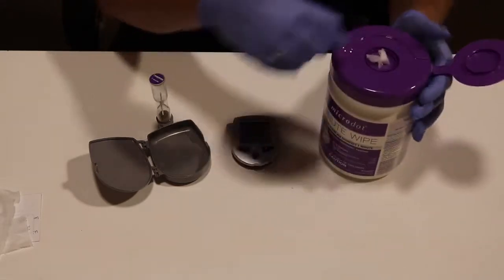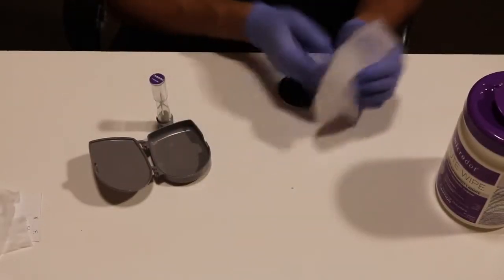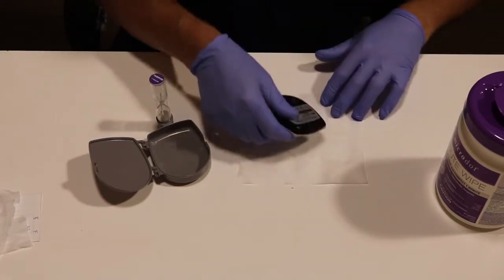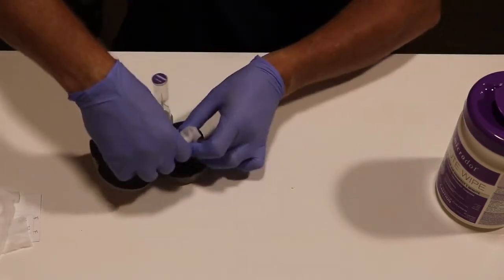First, open your wipes and grab a wipe. What you're going to do from here is wipe down your instrument, making sure the entire instrument is wet. Then place the instrument on the wipe face down and wrap the instrument in the wipe so that all the surface area of the instrument is being touched with the disinfectant.